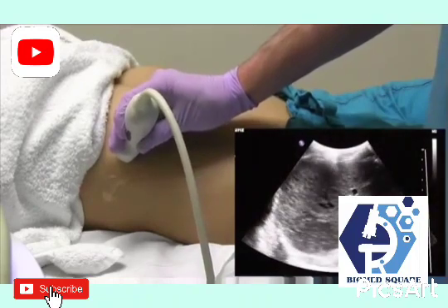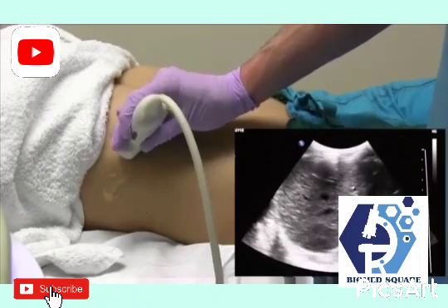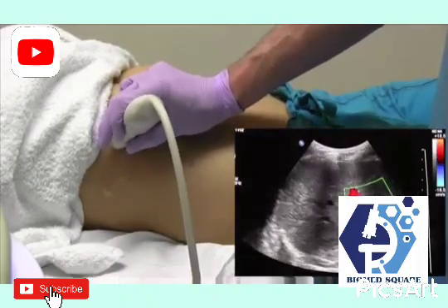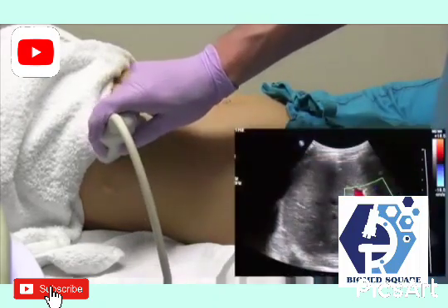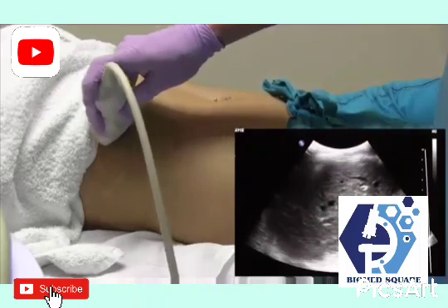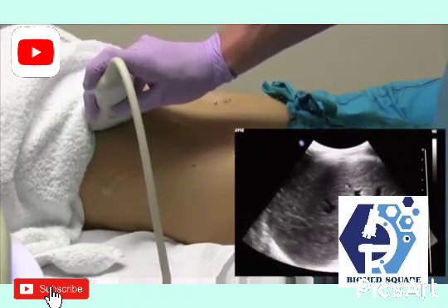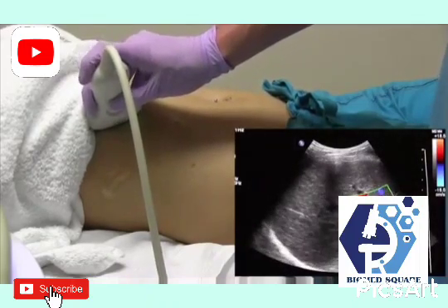So once you find that main portal vein, which you look for by the echogenic walls, you elongate it, and from there you know that the hepatic artery and the CBD are going to be right next to it as well. So once you find the portal, you can just keep tweaking the probe until you elongate the CBD completely. And if you're not sure whether or not you're on the CBD or the hepatic artery, just put the color on. Whichever one does not fill with color is the CBD.